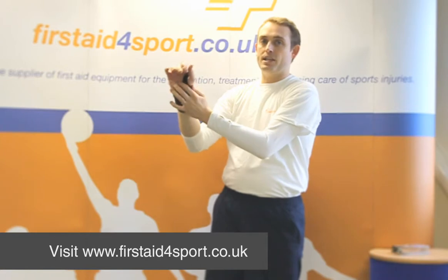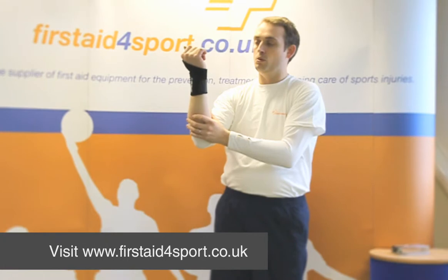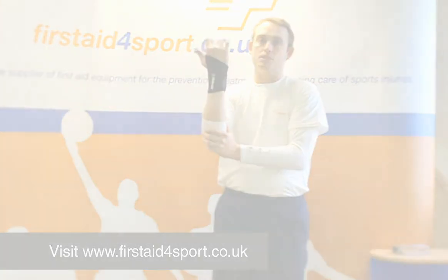As I say, it's a very basic brace that doesn't limit movement too much, however it does offer some support. So this is the McDavid Wrap Around Wrist Support.